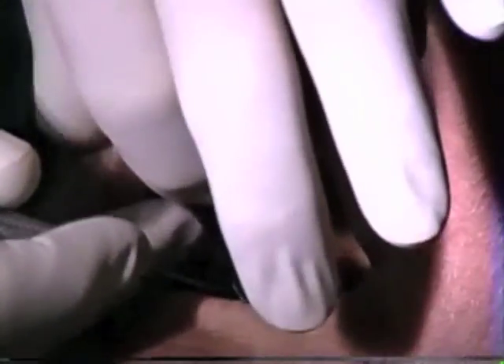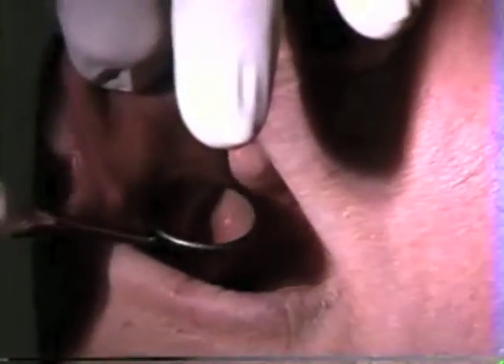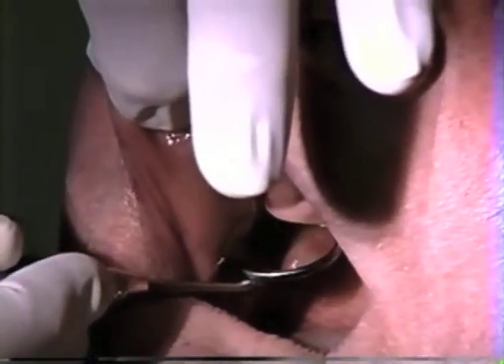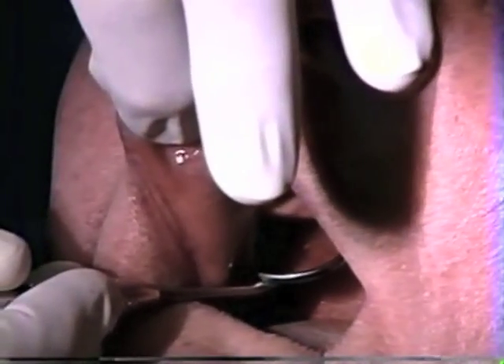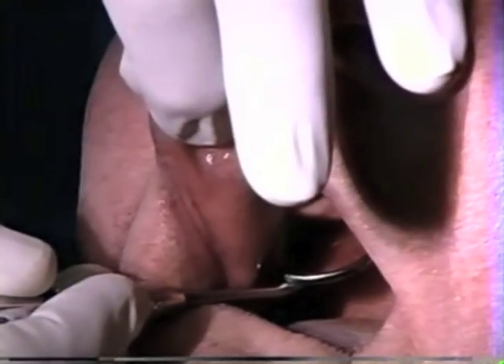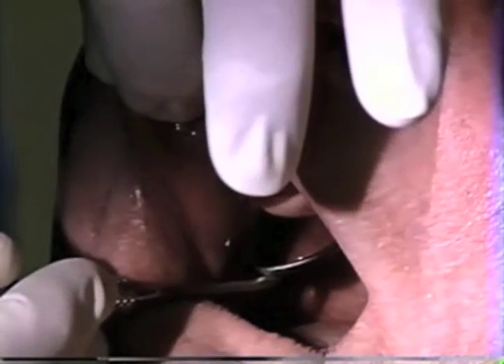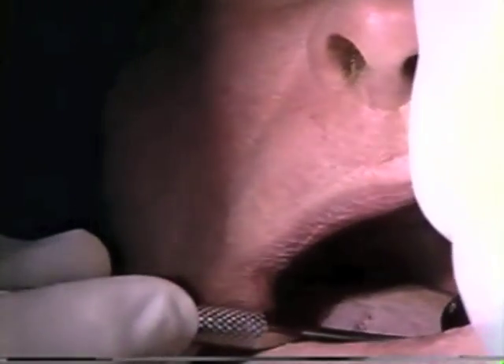Now we want to check for the hamular notches. The easy way is to take the head of the mirror, feel the tuberosity, and push it back feeling for the notch as you go back. You will feel it fall into that cleft between the pterygoid hamulus and the end of the alveolar ridge — that's the hamular notch and where the end of the denture would be. In this case that line is slightly posterior to it — we're about two millimeters too long in the right hamular notch area. On the other side it's slightly longer, about three millimeters.